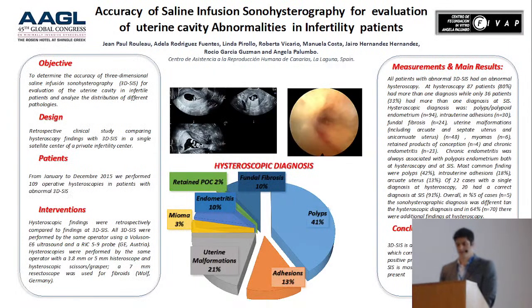Already in 2016, our group presented the following retrospective study in which the sensitivity of hysterosonography was evaluated. We compared 109 patients undergoing hysteroscopies who had undergone a previous hysterosonography. The results show that the correlation was very high.